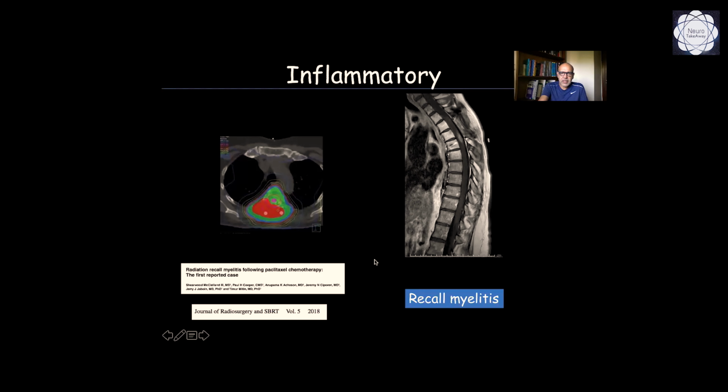Another case, this is another concept more recently described in neuroradiology. It is a concept brought from dermatology, which is the recall myelitis.